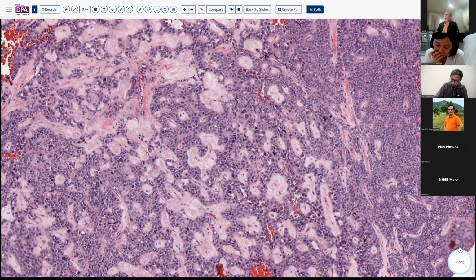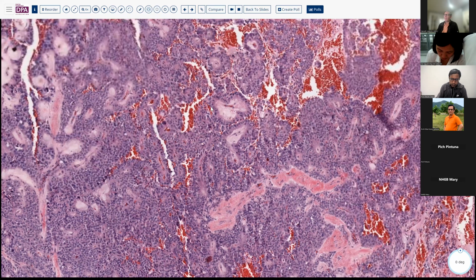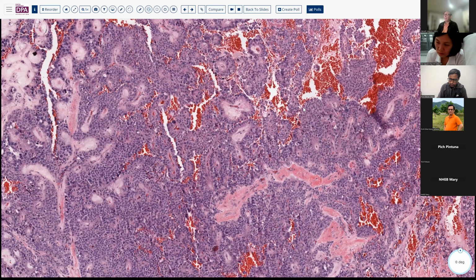And so it's looking very much like a neuroendocrine tumor. And so this is a frequent differential that we encounter. And that's where the value of the beta-catenin comes in. Now here we have more classical architecture with the pseudopapillae and the dissolved hemorrhagic areas in between these papillae.